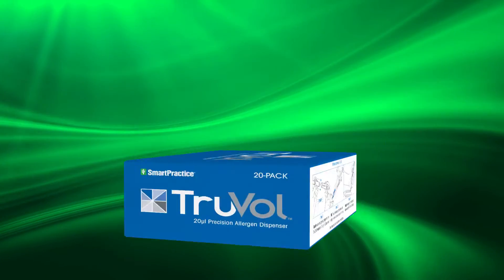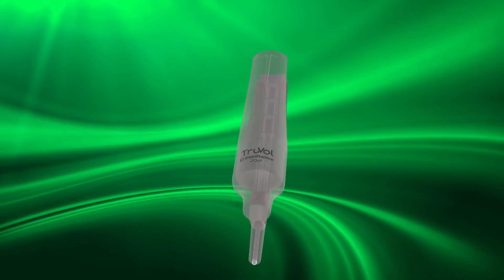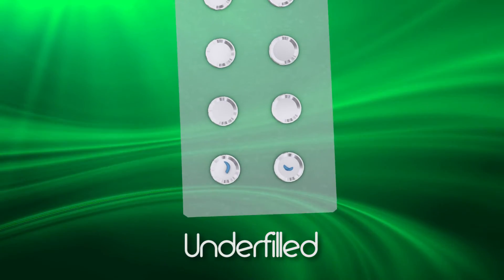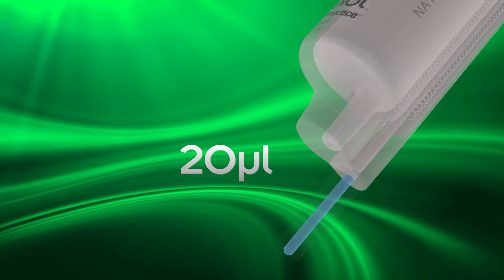Introducing the SmartPractice Truvol Precision Allergen Dispenser. Truvol takes the guesswork out of patch test dosing and improves standardization within your clinic. Overfilling or underfilling chambers is no longer an issue. Truvol delivers a consistent dose of 20 microliters of allergen to standardize patch test dosage.